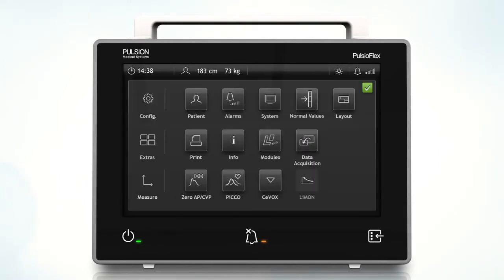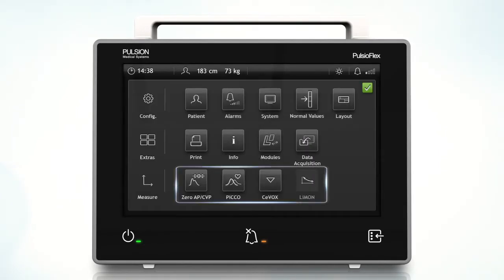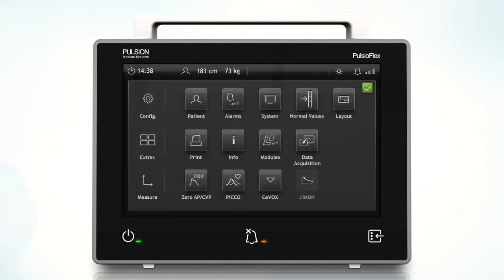For the measurements, you can enter with these buttons into the respective technology screens. It is recommended that only original parts be used in combination with the PulsioFlex device and its modules to avoid errors leading to more severe problems.